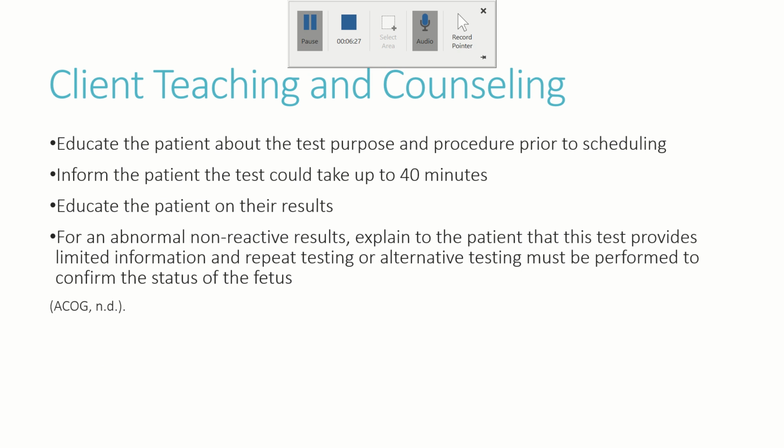Important client teaching, education, and counseling include educating the patient about the test purpose and procedure prior to scheduling, informing the patient that the test could take about 40 minutes, and educating the patient on their results. For an abnormal, non-reactive result, explain to the patient that this test provides limited information and repeat testing or alternative testing must be performed to confirm the status of the fetus.